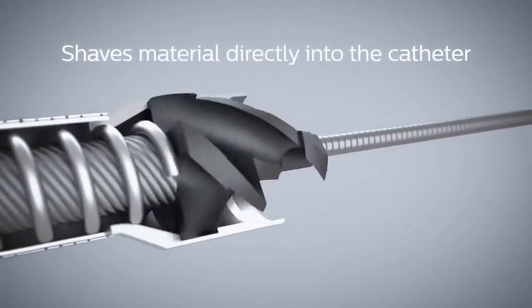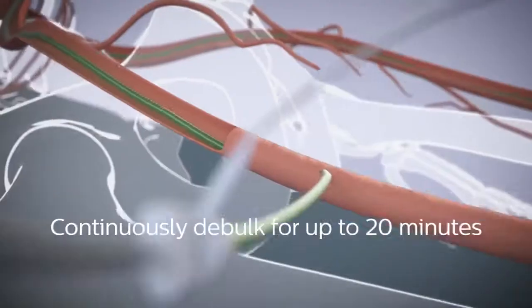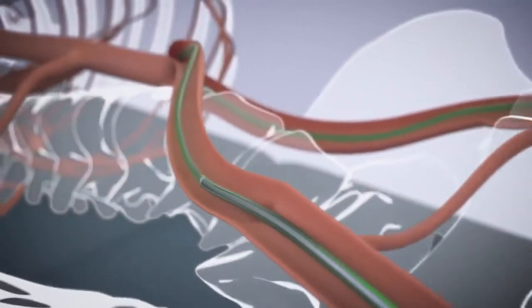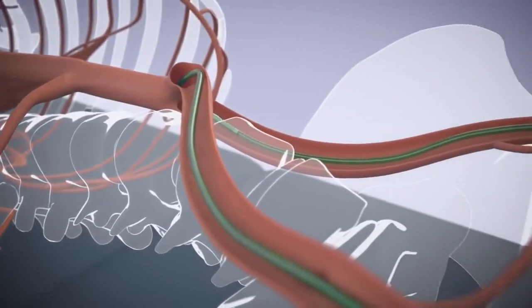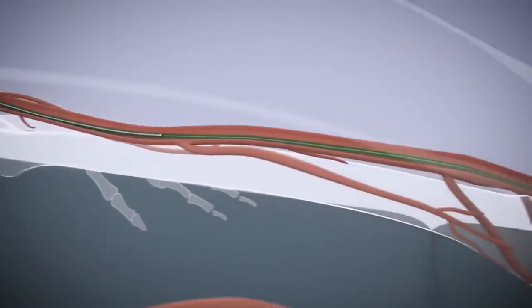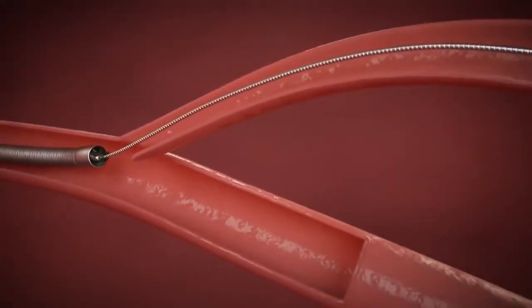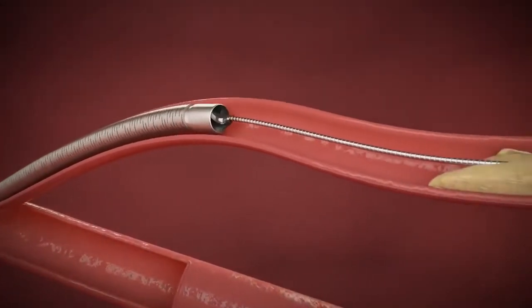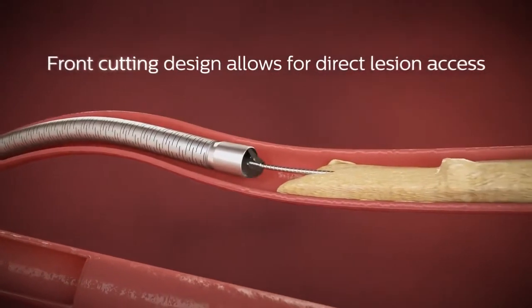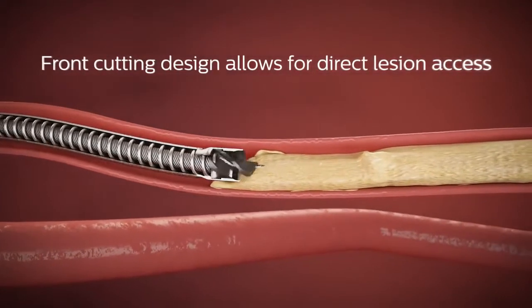The catheter is uniquely designed so that material is shaved directly into the catheter where it is captured and contained. The over-the-wire design provides support to aid pushability and deliverability, and has been proven effective in navigating tortuous anatomy. Because the cutting element is located on the distal end of the catheter, the Phoenix can immediately begin treating highly stenosed lesions without having to first pass a nose cone.